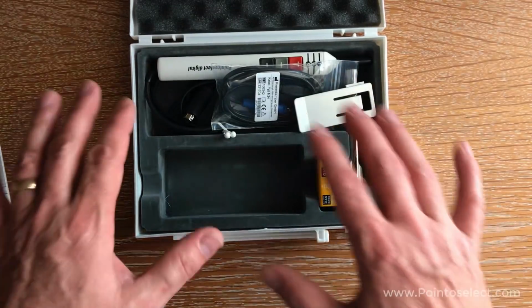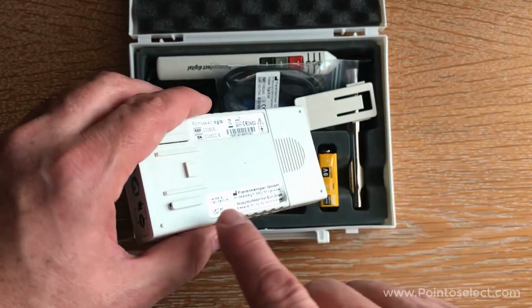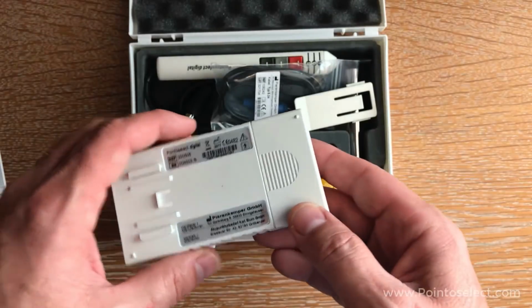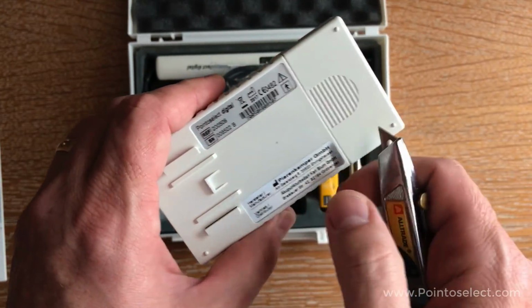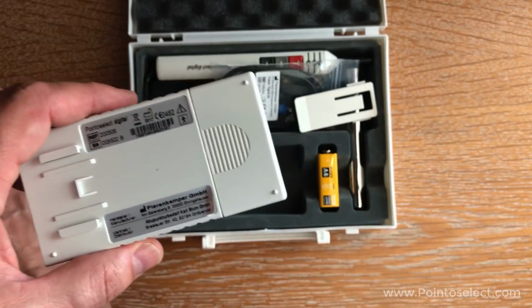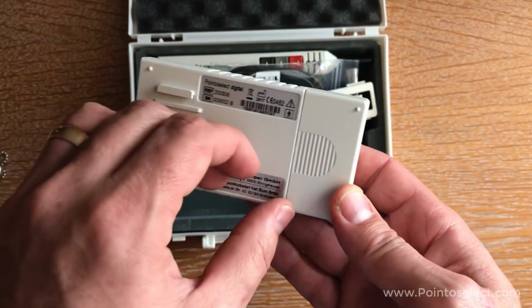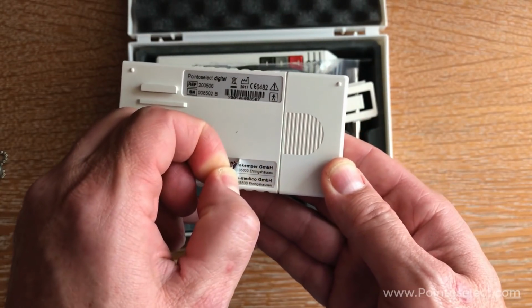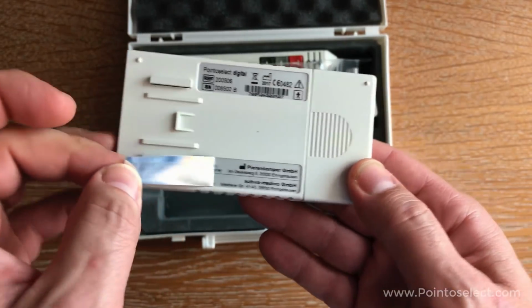Okay, so as I was packing everything back up, I just noticed something really interesting. I noticed that these stickers didn't quite seem to fit down into the cutout in the plastic. And so I got a little curious and just lifted the corner of this sticker here. And as you can see, there's another sticker underneath it. So there's a sticker on top of a sticker. I did not peel it off yet because I wanted to do that on camera. So I want to see what it says and why there's a sticker over a sticker.